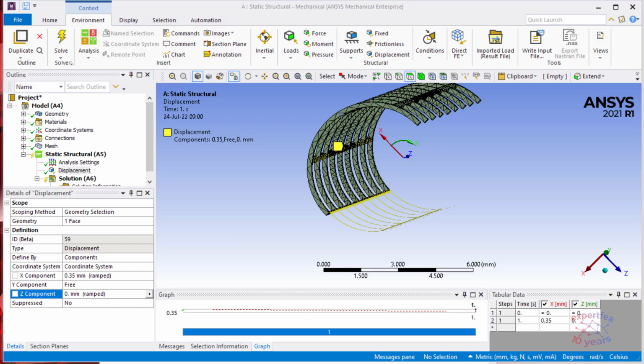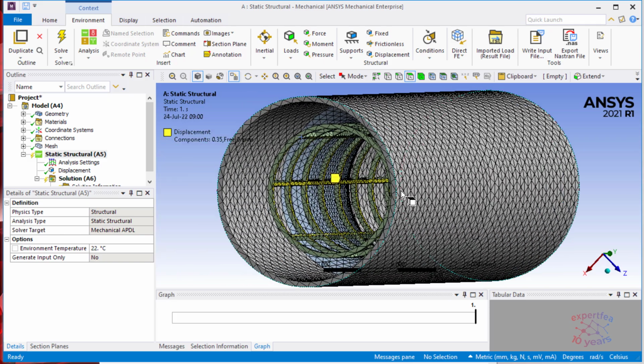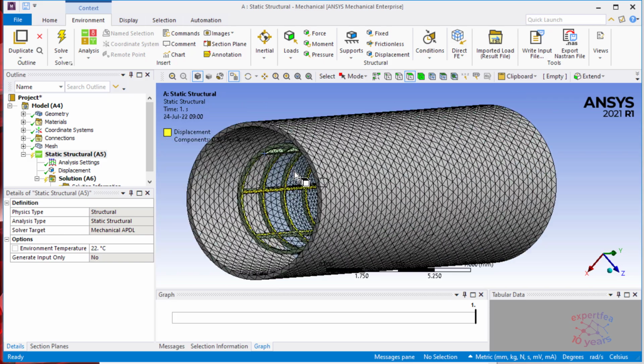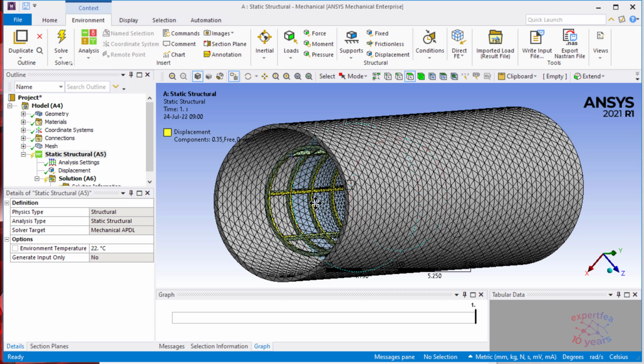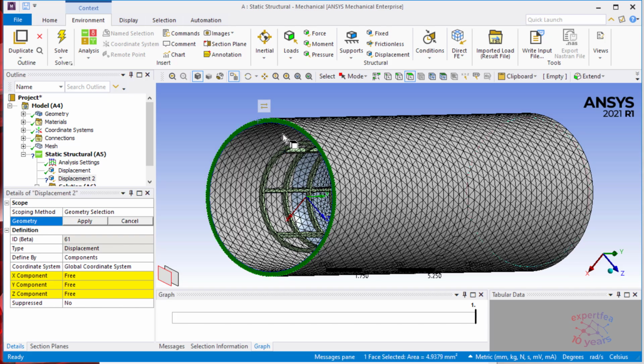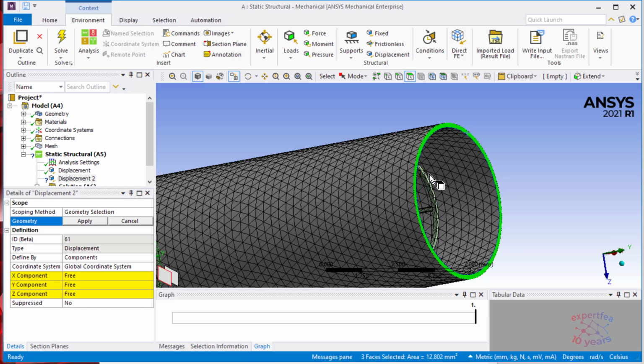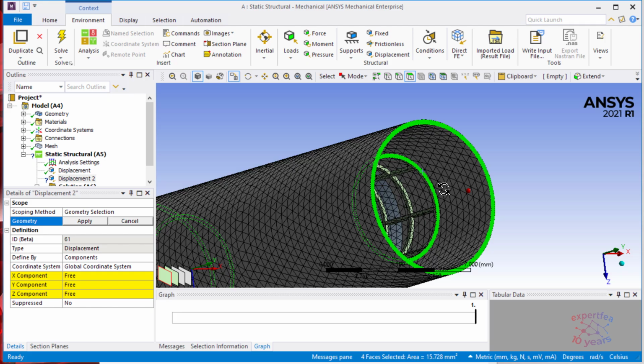So another displacement will be sort of like fixing the bodies. Let's somehow fixate the extremities, the sides of the vessel and the stent. It's very easy to just select these lateral faces with Control pressed. I'm talking about the blood vessel and the stent. Apply.